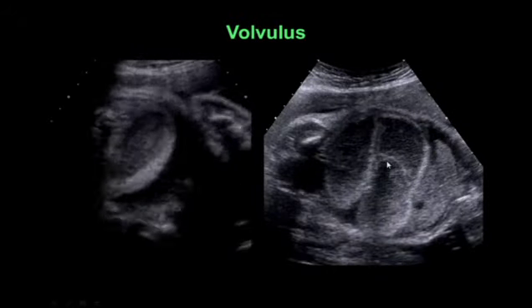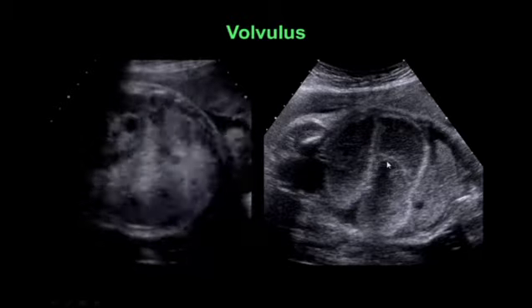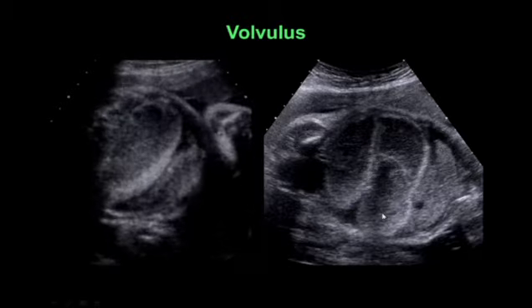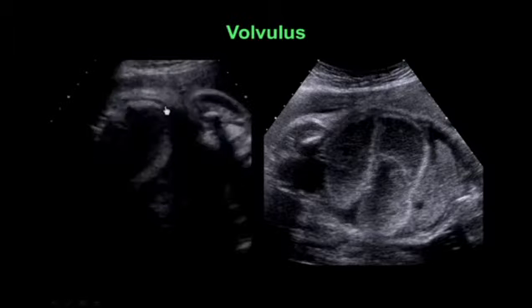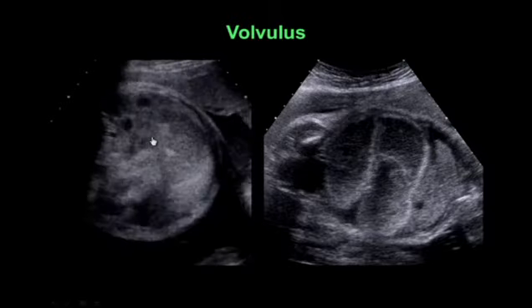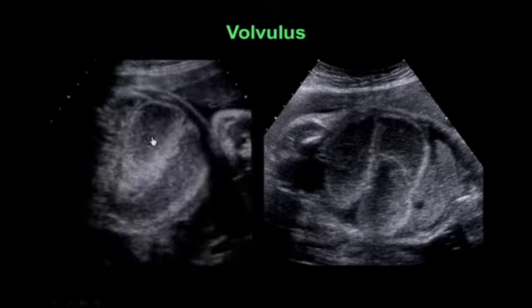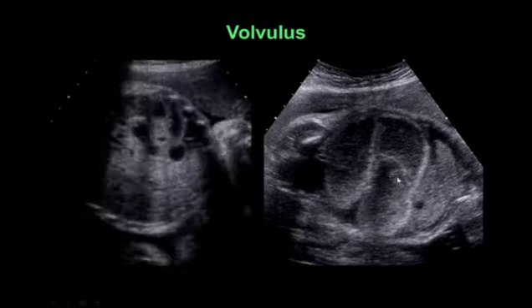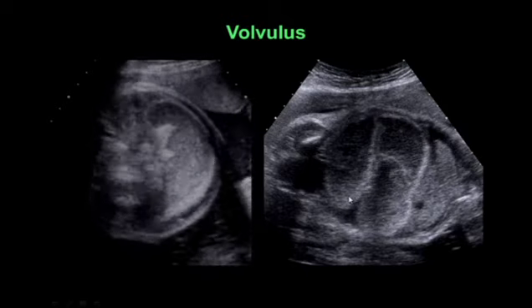Here's one later along in gestation, a different one where there was a volvulus. You can see this single, very large dilated loop of bowel, and then you can see on the clip some smaller dilated loops of small bowel proximal to the site of the volvulus. Also notice there's some free fluid. This loop of bowel was necrotic by the time the baby was born.